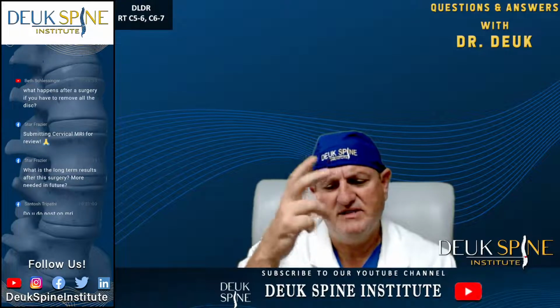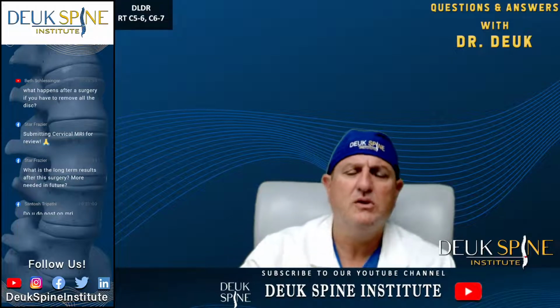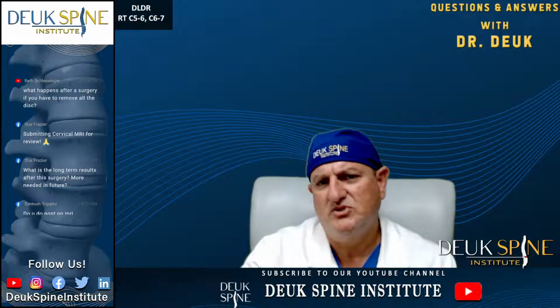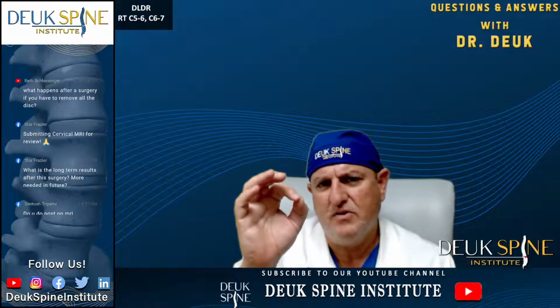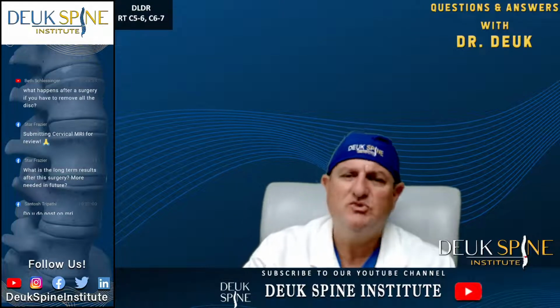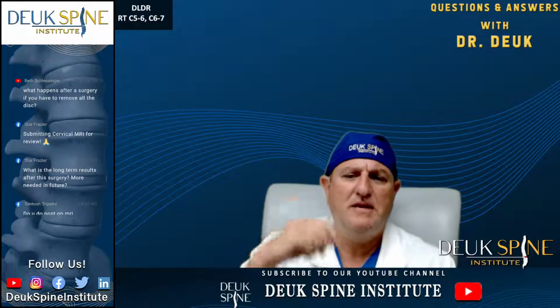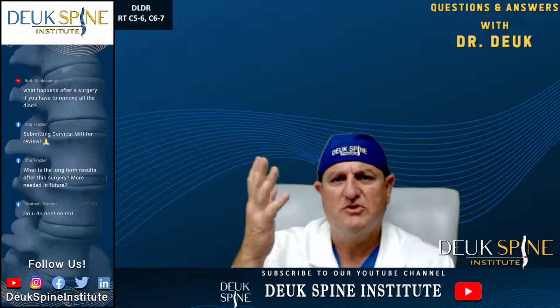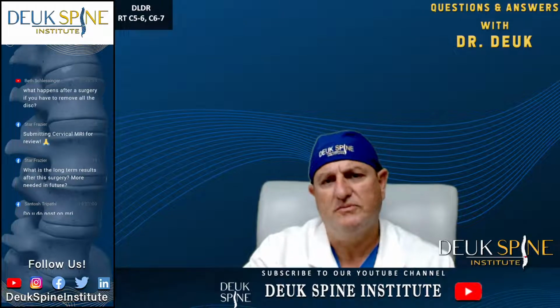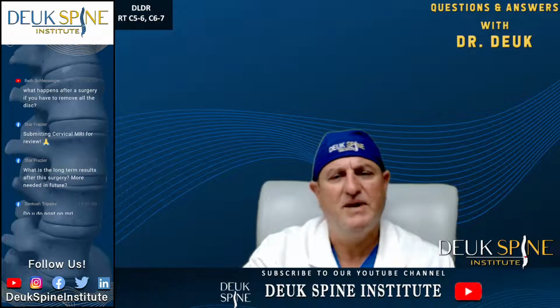I use the x-rays to navigate. I use the x-rays to localize. You saw that during the surgery. You can notice if you watch my surgeries, I do it exactly the same way every time. Why? Because once you have the very best way to do something, you want to repeat it over and over and over again. That's what surgery is. The best surgeries in the world are those that are reproducible, and they give you the same exact best result.